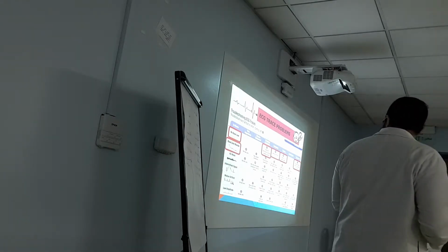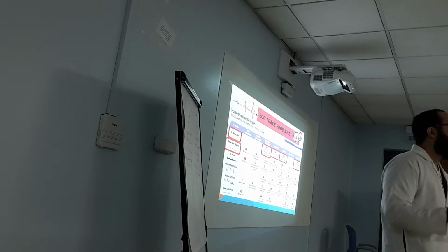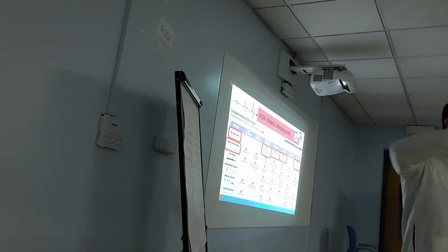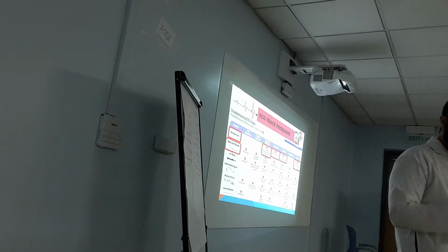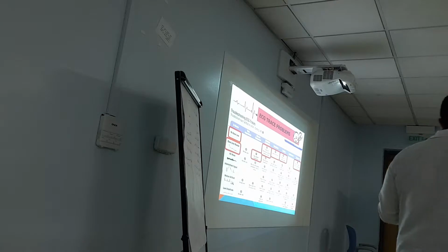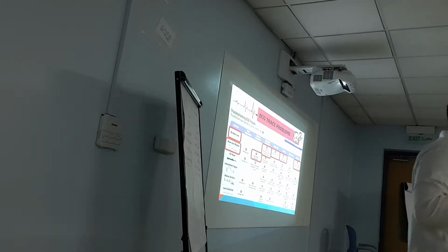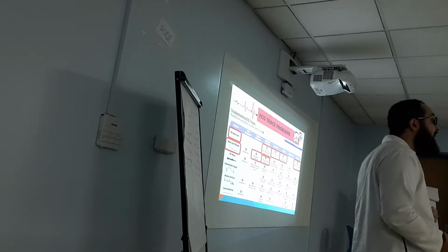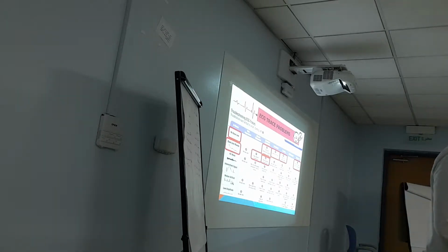Now if I have another problem, baseline wander. So what's baseline wander? You see the ECG, but it's not going in a flat line. It's going up and down like this picture. So what is the meaning of this? What would be the possible reason? Patient is moving, okay? He is moving too much, or you are not connecting the ground lead, which is the right leg lead, okay?